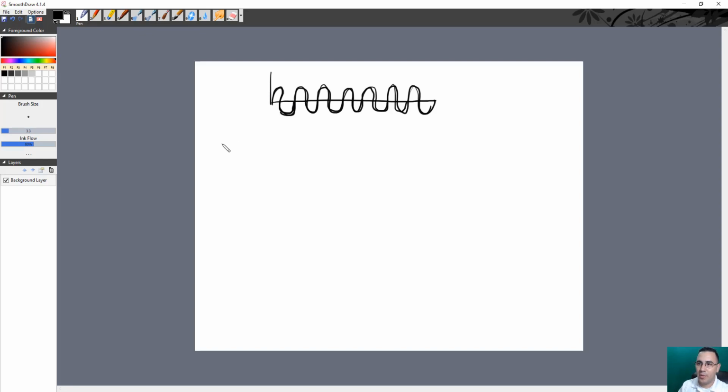Let's say, for example, the first one that we're going to look at is the period. The period is just basically time. Time for what? Time for the cycle. So we're talking about time here.